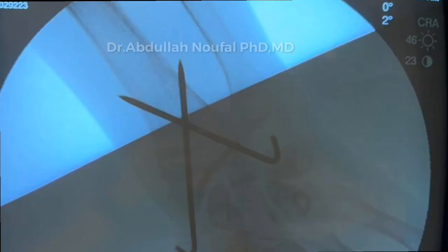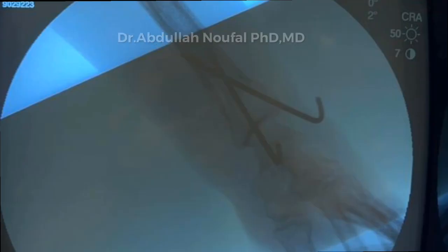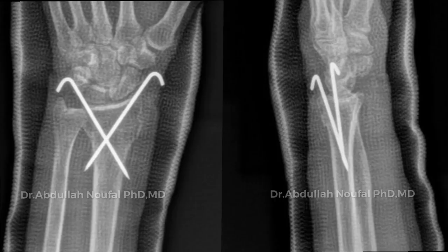The medial one is usually inserted from the medial radial angle, medial to Lister's tuberosity, and proximal to the surface of the joint. To give an ideal fixation, we should avoid crossing the K-wires at the level of the fracture line in AP and lateral views.